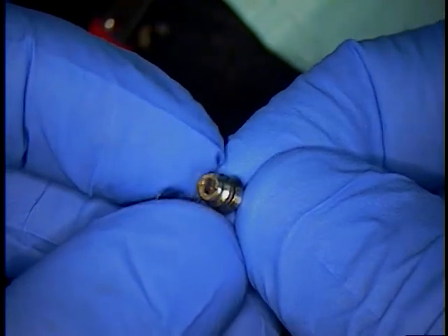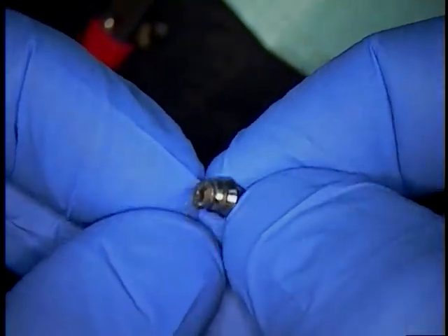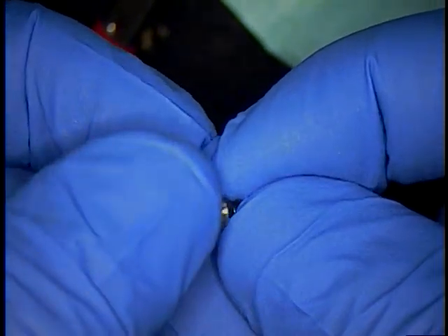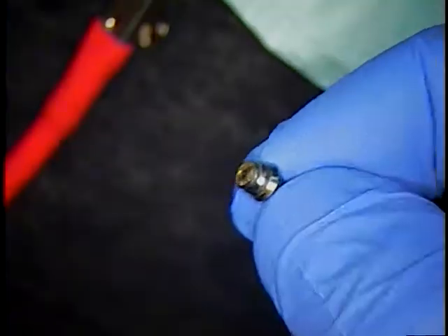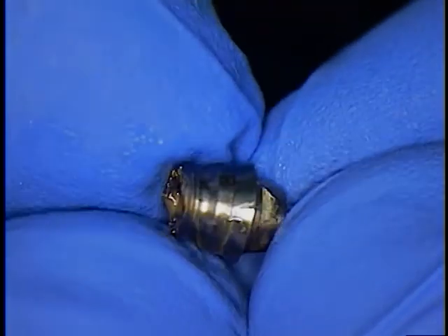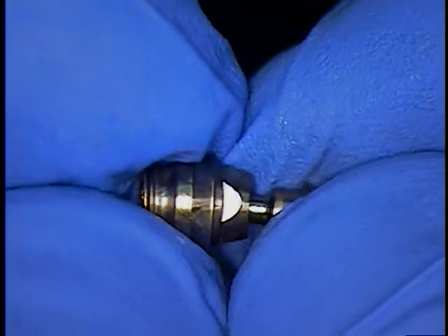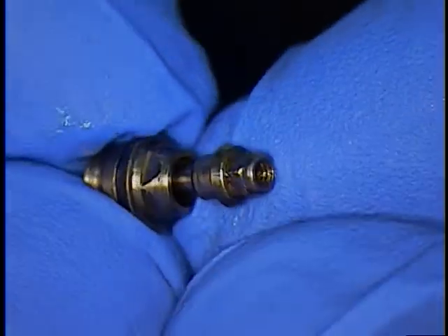Yep, that one's, well, no, it's the top of the implant that is fractured. That one's broken. Yeah, I wish I had better news for you on that one. That's 14, that's a broken implant abutment. See the fracture there? And the type of titanium. Ouch. That's a multi-unit abutment.